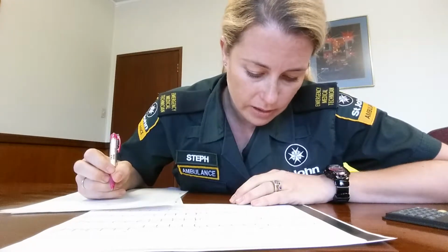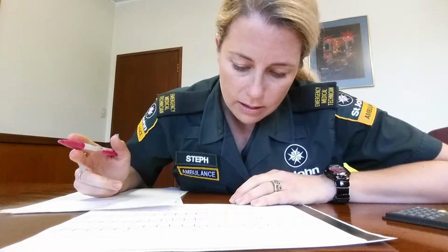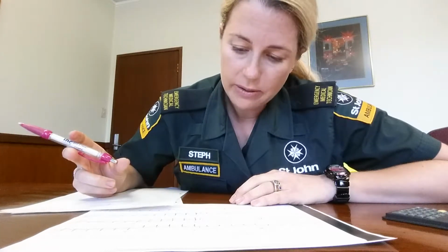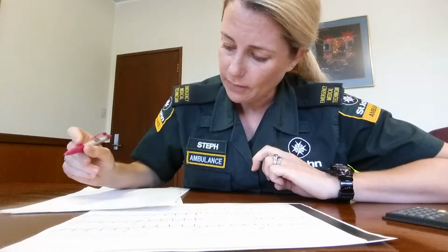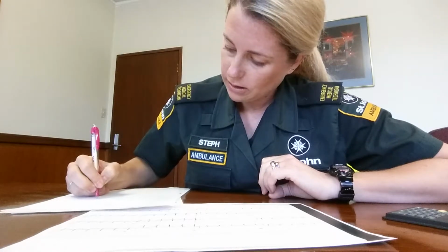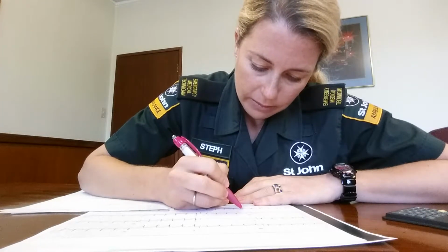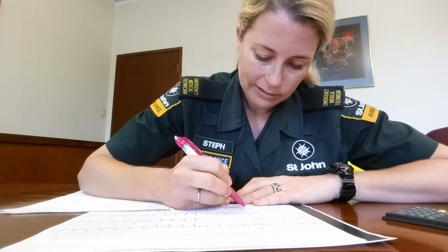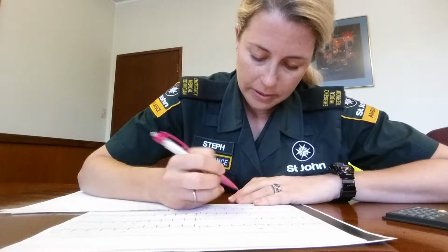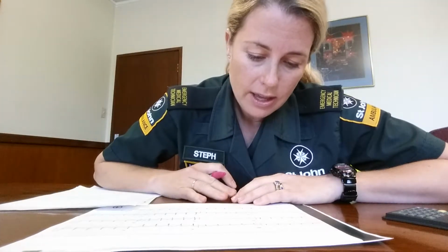Q waves. Do we have any Q waves? Little baby Qs in 3 and AVF. They don't meet the criteria of being more than 0.03 seconds wide or 1/3 the height of the R wave. My QT interval, because we're at a regular rhythm, I can go the half RR rule, which it's about right on halfway, maybe a little bit less, so we don't have any QT prolongation there.